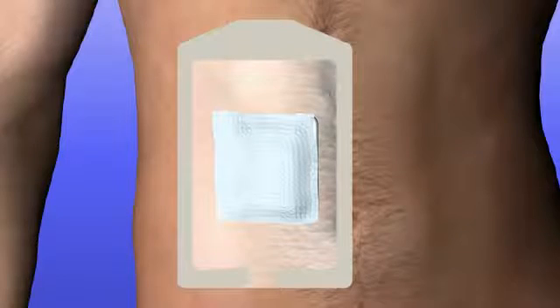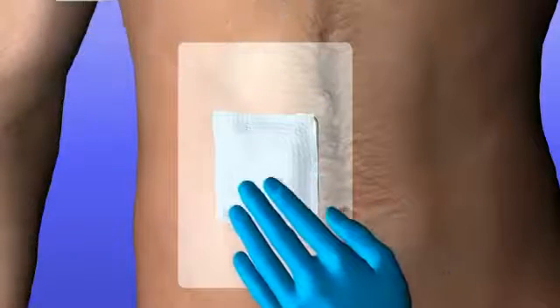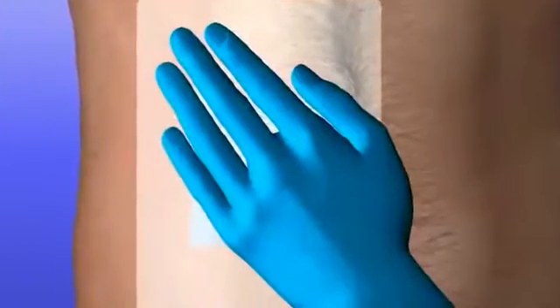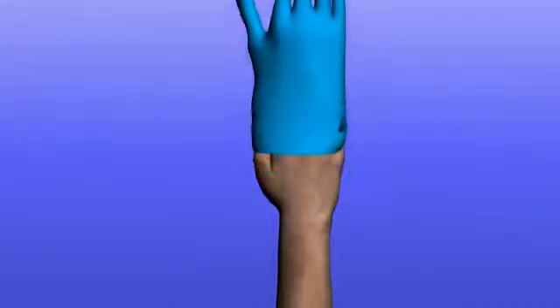Slowly remove the remaining paper frame by peeling it off on the split section while smoothing down the dressing edges. Once removed, smooth the entire dressing from the center toward the edges and firmly push down the dressing. Remove your gloves and discard.